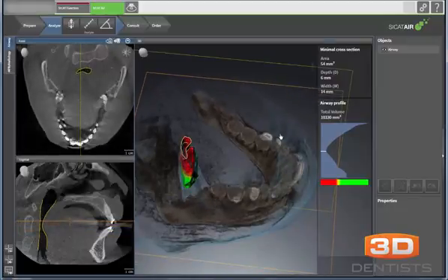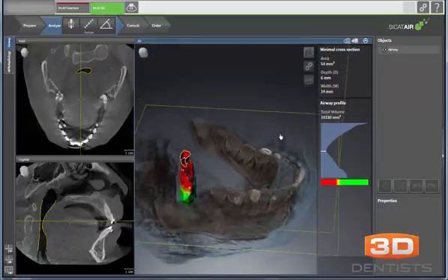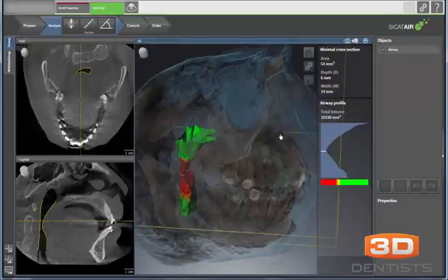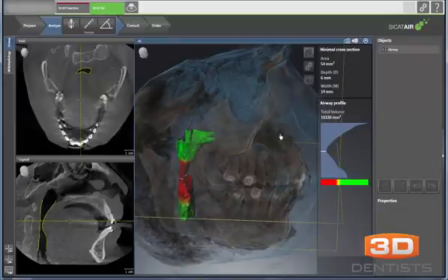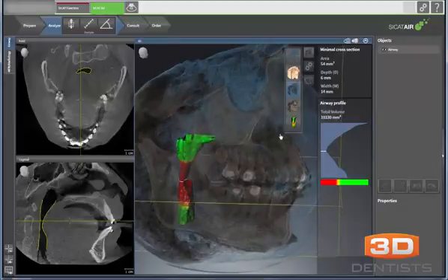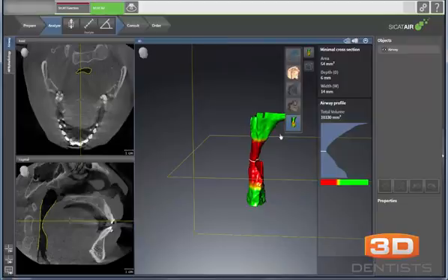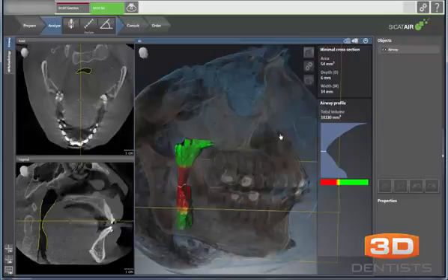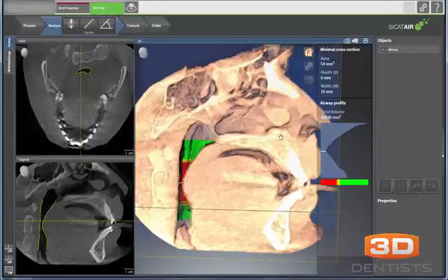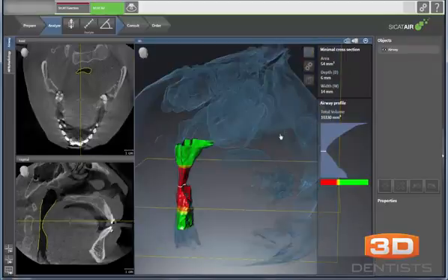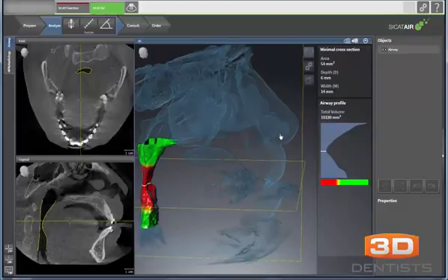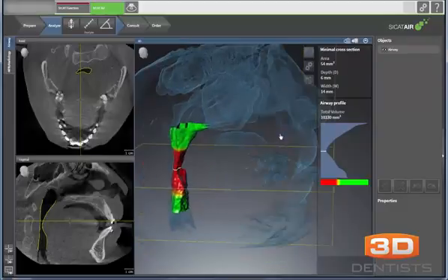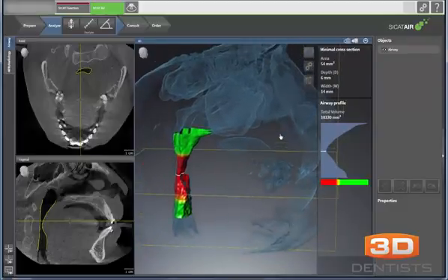Just an introduction into how to create the segmentation and some of the various things we can do with it. We can show just the airway, the airway with a bone model, the airway with bone and soft tissue, the airway with a flat image of everything, or the airway with just the soft tissue landmarks. Just to give you an idea of what is possible here. Thank you and I hope you found this video helpful.